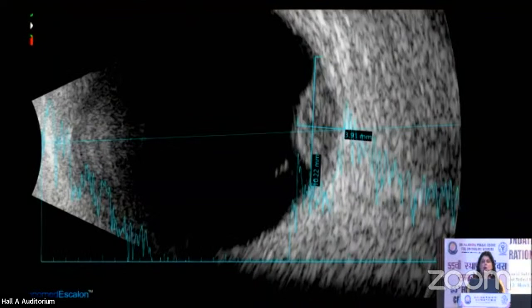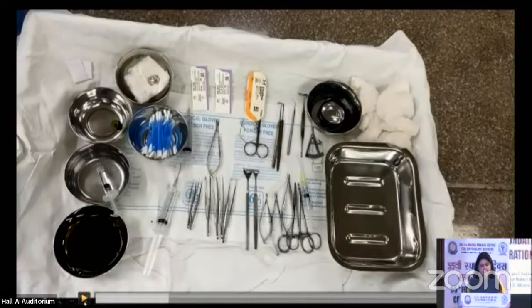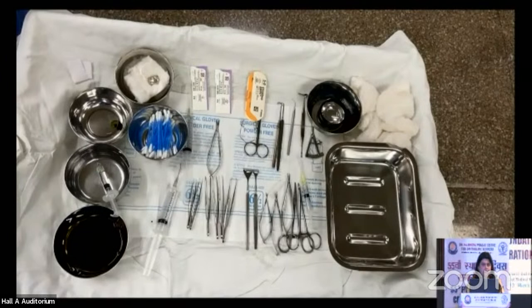Now here again, I would like to pause a little bit and show you what all instruments we need for this surgery. So here you can see that there's a dummy plaque over here. What do we mean by a dummy plaque? A dummy plaque is very similar to the actual radioactive plaque that we are going to use, but we cannot keep the radioactive plaque openly like this for such a long time. So we use a dummy plaque initially to be able to secure the exact position and placement of the plaque on the sclera, to mark the points to anchor the sutures. So that is why these dummy plaques are used. This one is not radioactive, but it is designed exactly like the original radioactive plaque.